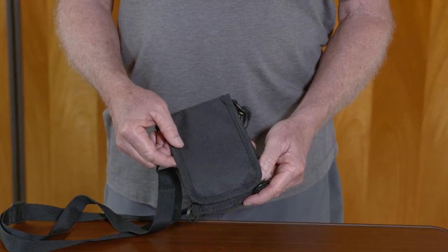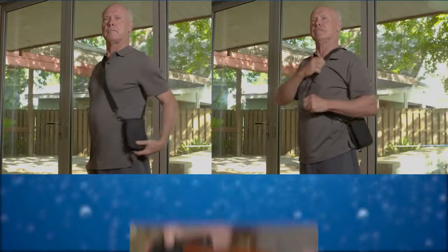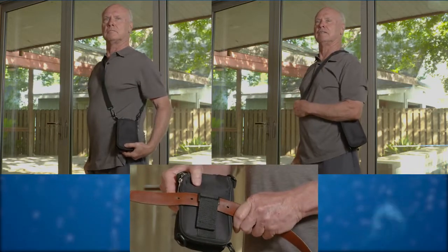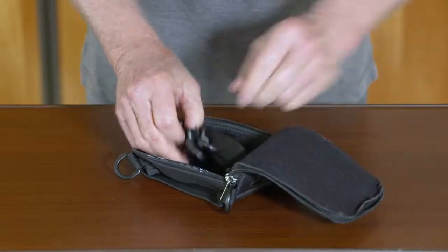The universal carrying case offers simplicity and convenience as well. It can be worn cross body, over your shoulder, or on the belt loop. When you unzip the carrying case, you will find the strap for the case inside.